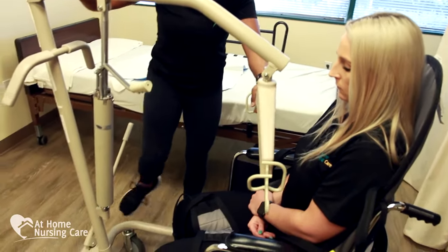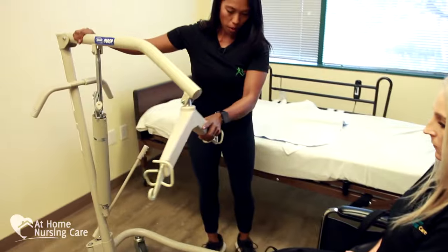It basically helps people not lay in bed all day long when they have a debilitating disease, so it's important to learn how to use it if you're going to face that situation. There are lots of different devices and a lot of different patient circumstances, so we're just going to give you a general idea of some best tips. Let's get started.